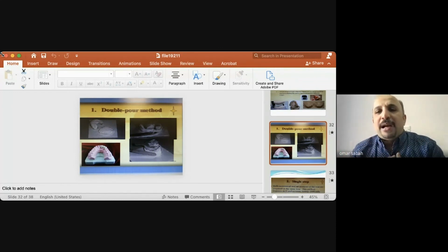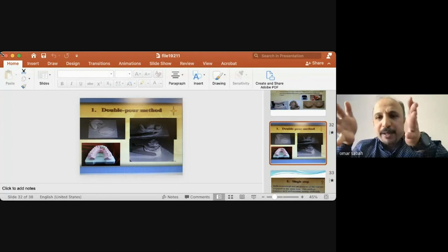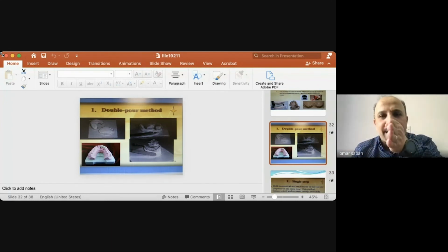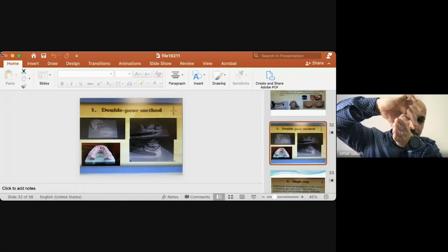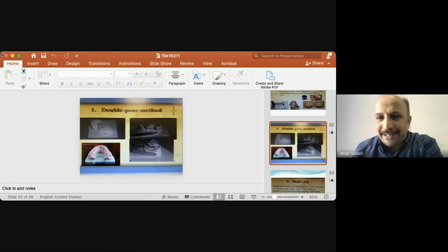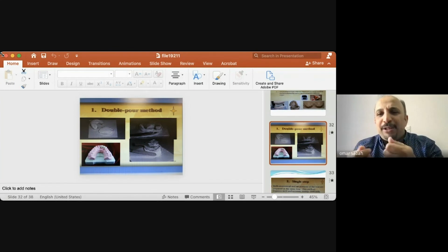بس المشكله وين؟ انا هسه اذا اجيب ان شاء الله بالرابع وبالخامس من تاخذون بيشنتس التري على بيشنتس، تاخذون امبريشن للدنتشرز، مرات يجيني بيشنتس يعني اجيب له التري اللي هي ريدي ميد، اوكي، كلش كبيره، يعني الريدج، خلينا نقول هذا الخط هو الريدج وهذا التري هاك مسافته كلش كبيره. زين، انا هذه اذا استخدم له فلوبل ماتيريال وين راح تروح؟ راح تمشي، ما تسجل شيء، لانه هاي من تكون ثين ماتيريال راح تعبر وتروح وما تسجل كل شيء، لانه ماكو شيء ماسكه.